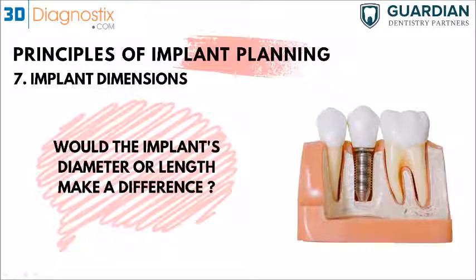Yeah, but in the end, with both guides, if you're either using the guided Versah or just using a pilot drill, for example, to drill the osteotomy and continue with the Versah freehand, you're going to have to remove the guide and place in the implant freehand, because with the Versah sleeve, you're not going to be able to place it through the guide. Got it. So you need to take, in the end, the guide out and place in the implant freehand. Awesome. Thank you for that.